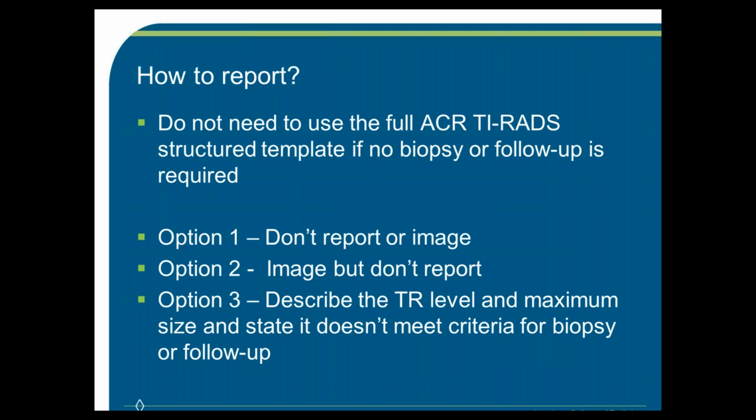So on to how to report. Well, my recommendation would be that you certainly don't need to use the full ACR TI-RADS structured reporting template that I showed you last time if the nodule is below the threshold for biopsy or follow-up. Now, the option is if you're not doing that, you can either not report or image and tell your sonographer not to image. You can image it, but don't report it. And then the third option is to just state in a sentence the TI-RADS level, the maximum size, and state that it doesn't meet the criteria for biopsy or follow-up.